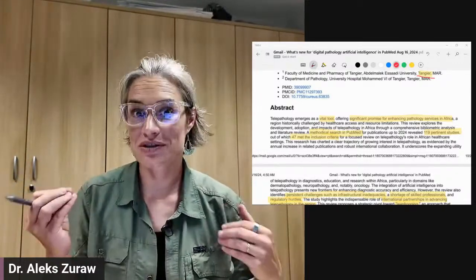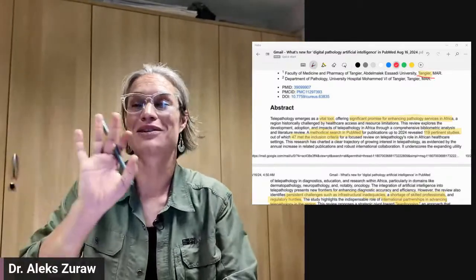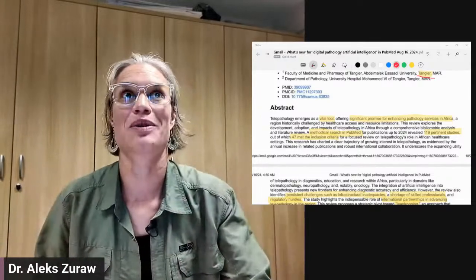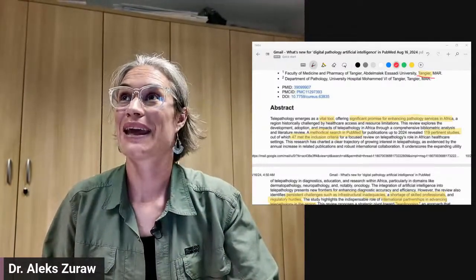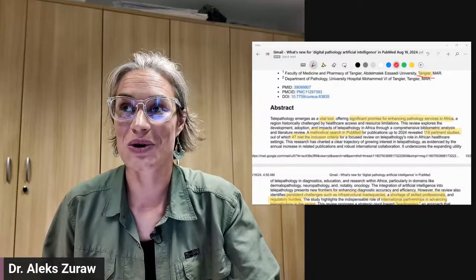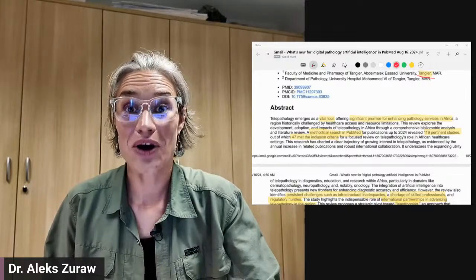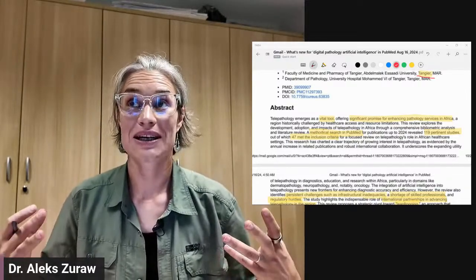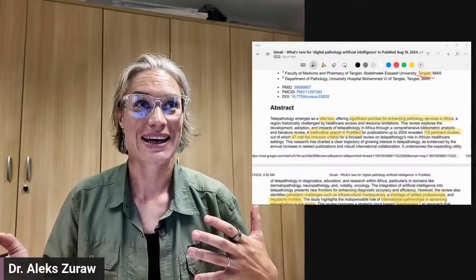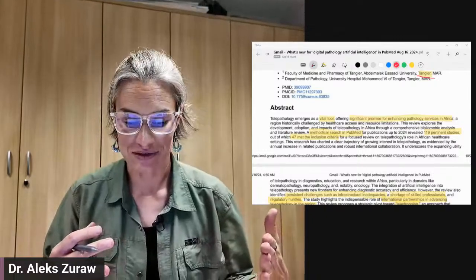static telepathology, so digital images, is used for education through social media. And I showed different accounts, including mine, which I don't use too much for pathology images. I talk more about digital pathology, but there are online educators in the veterinary pathology space and in the MD space even more that have accounts with tens of thousands of followers who want to learn about cytology, about pathology on static images through social media. So there's definitely a huge impact through the non-traditional channels.